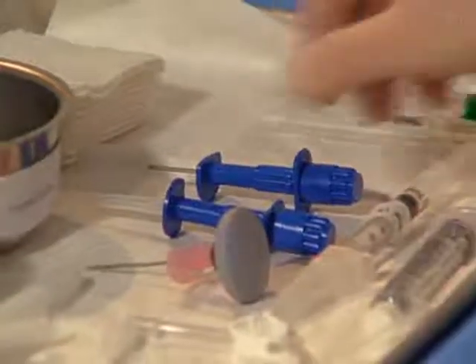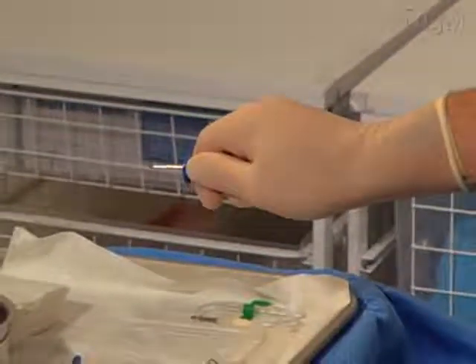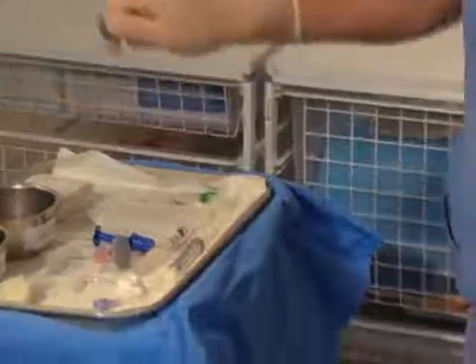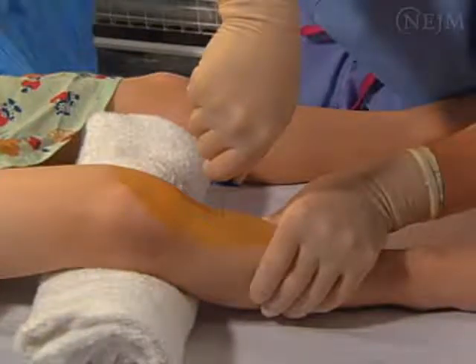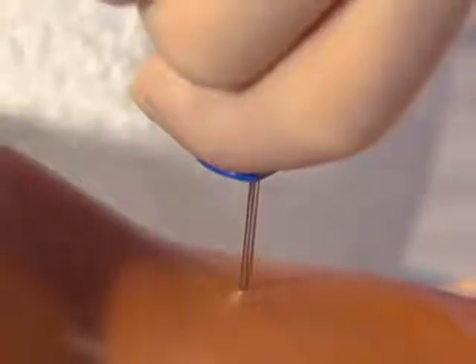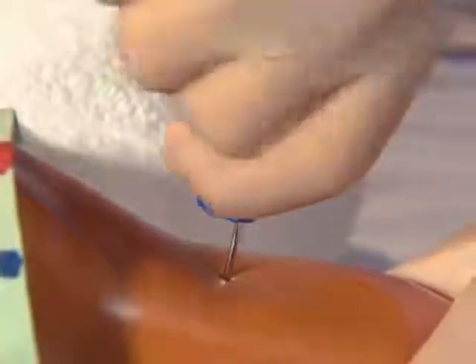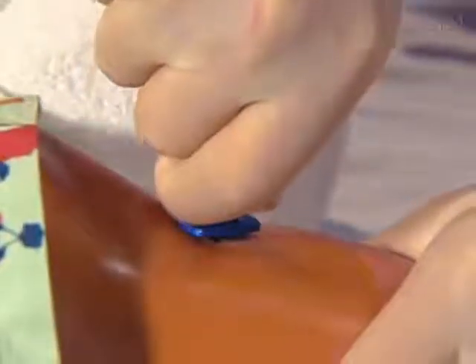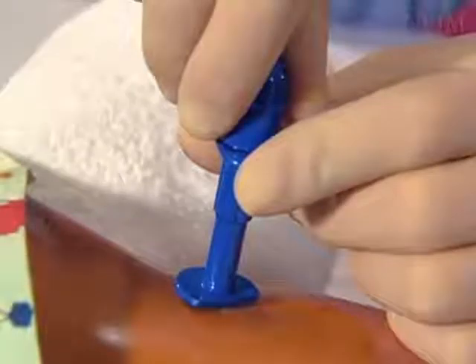Place the needle handle in the palm of your dominant hand. Place your thumb and forefinger along the shaft of the needle for stabilization. Place the needle against the skin overlying the site. Puncture the skin and continue through the soft tissue. Use firm, steady pressure and a rotating or coring motion to penetrate the bony cortex. You will note a sudden give with the loss of resistance as you enter the medullary cavity.